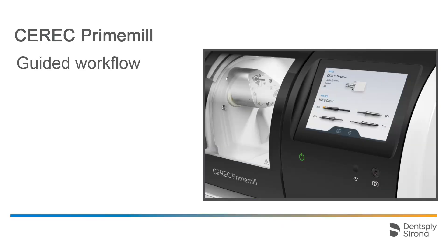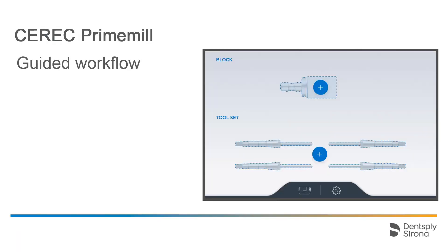Next, we come to the guided workflow. CEREC PrimeMill is equipped with a powerful touch interface that guides you through all the workflows. Here, the start screen of the CEREC PrimeMill is displayed. In our case, the device is not equipped with a block or any instrument set, indicated by how the symbols are displayed and the plus sign at the center.